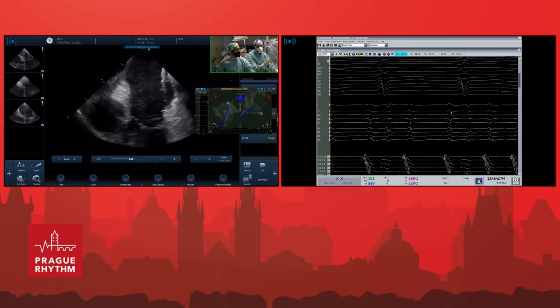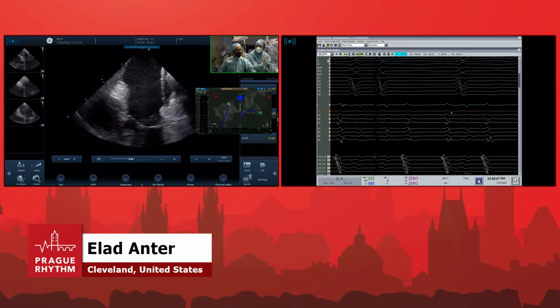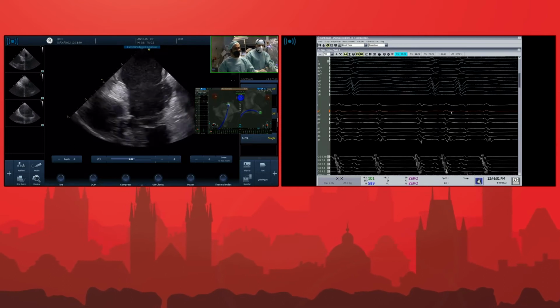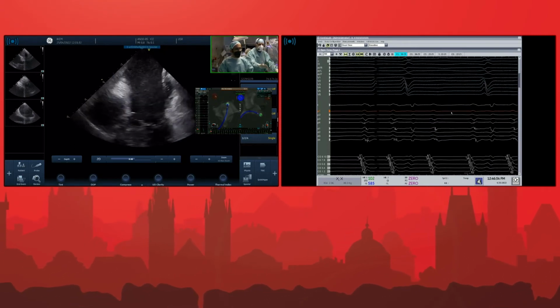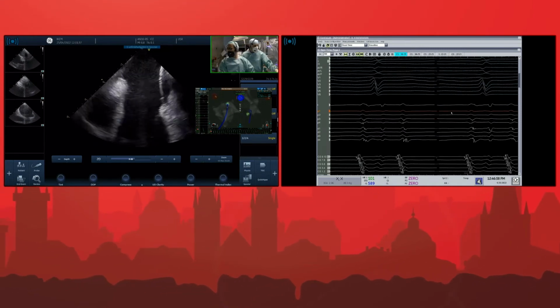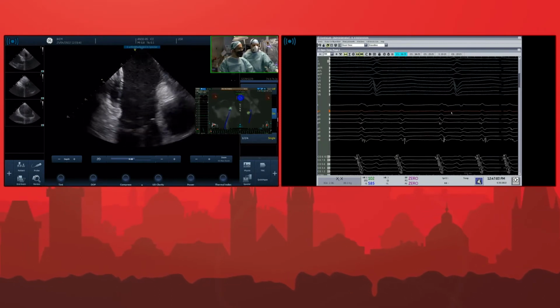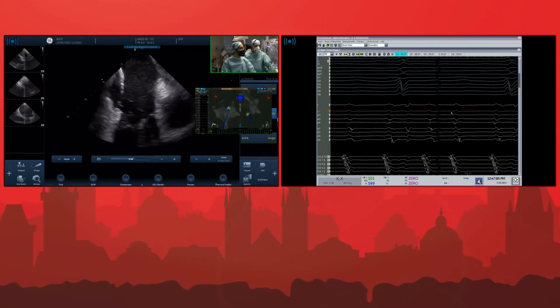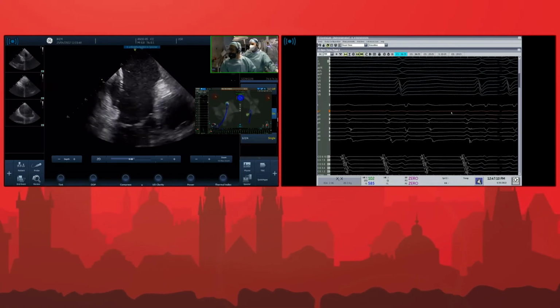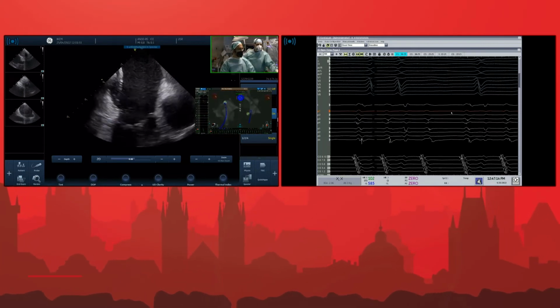One comment about the ICE image, it's flipped like they use in Philadelphia, probably because you are used to it. So this is not what we are normally used to. It's just a mirror image. What is on the right hand is usually what we see on the left hand. But if the audience wants, we can flip it. Yeah. And we're going to use RF to create the CTI line. We can do it with pulsed field, but we showed you most of the case with RF.